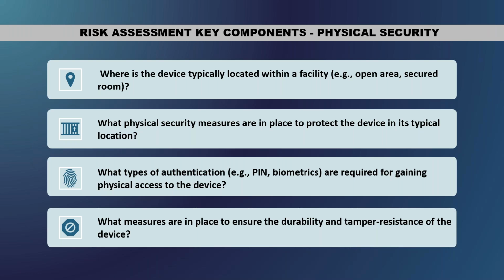Because the problem is that if it's mobile and moving around, a lot of people are able to just plug in a USB that could corrupt the system or hack the system, right? So try to understand those security measures. Where are they in place? How protected is it? If someone gets access to it or steals it, are they able to access all the database, or how are they authenticating, with a biometric or a PIN number? Those are some of the questions that you need to ask.